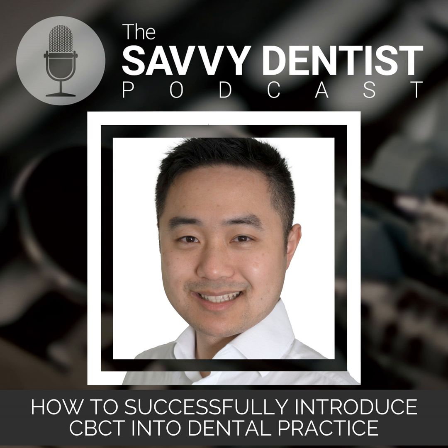CBCT is really an acronym for cone beam CT, so that is cone beam computed tomography. What it is, is actually very similar to an OPG that I'm sure a lot of listeners are familiar with. It's an X-ray machine in basic terms, and it fires the X-ray in the form of a cone, therefore cone beam. Yeah, very intuitive there. But what it does is it acquires the image or the target structure in a 3D data set. So instead of being 2D, as we see in an OPG, it is 3D.